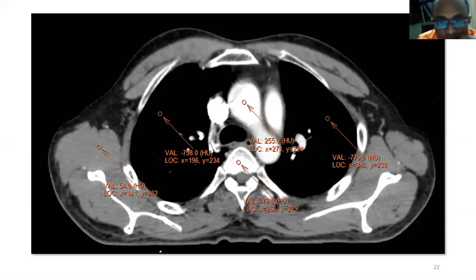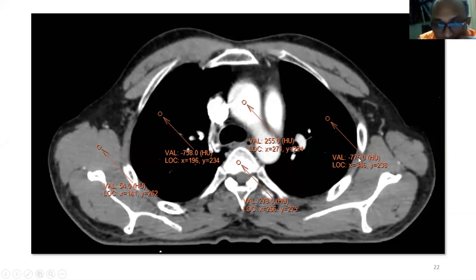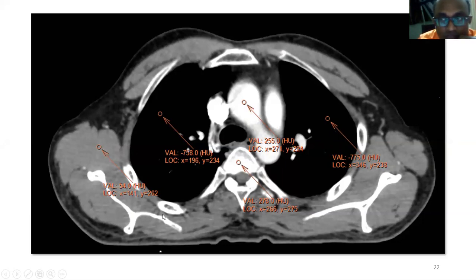How to measure Hounsfield unit: if you have a picture archiving communication system (PACS), you take the CT and just drag the measurement tool. You can see the contrast area is around 255, lung is minus 775, bone is around 270, and other structures have their own values. You can measure Hounsfield units in various structures in the brain as well.